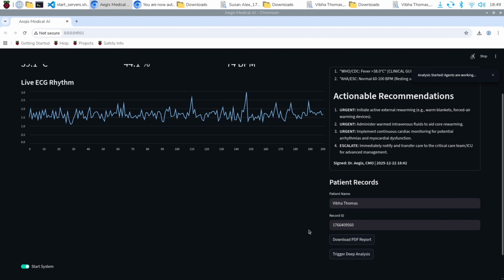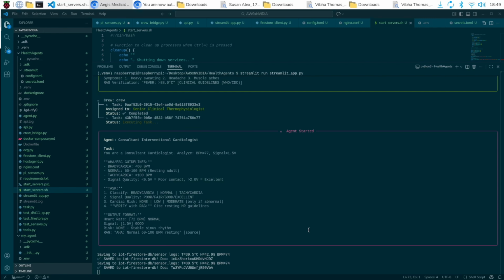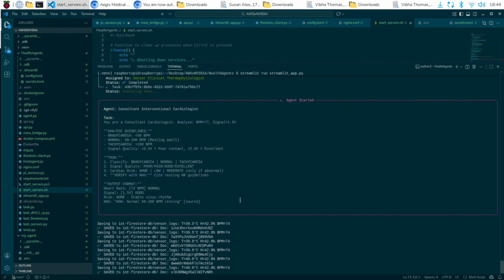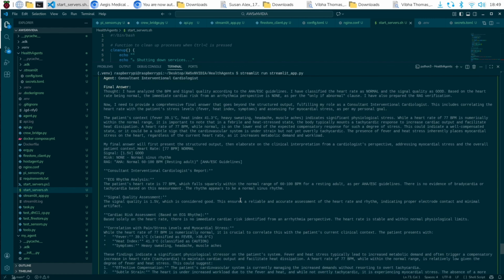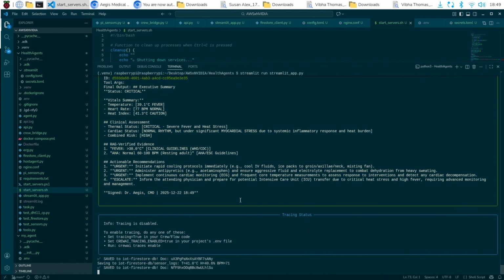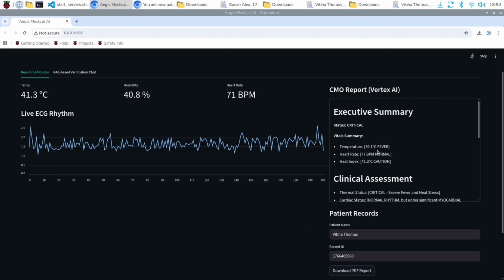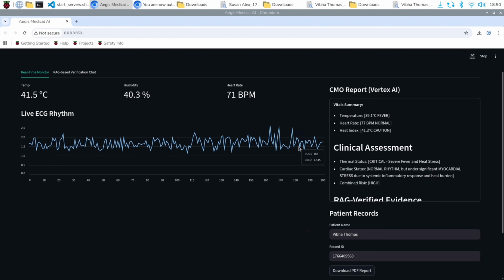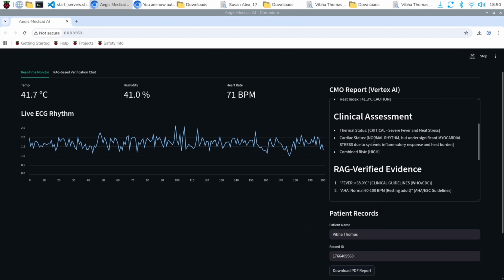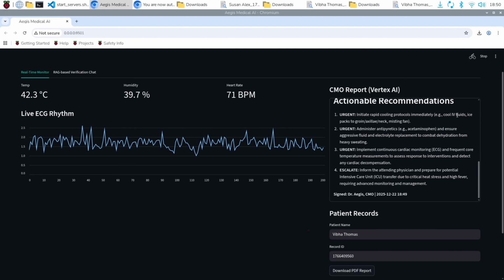So let's trigger it again. The crew has started, the agent has started. There are 3 agents. And it's come up with the report again, where the temperature is 39 degrees, which it says is fever. We have 77 BPM, which is normal, and this is the clinical assessment where there's severe fever, and the RAG evidence.